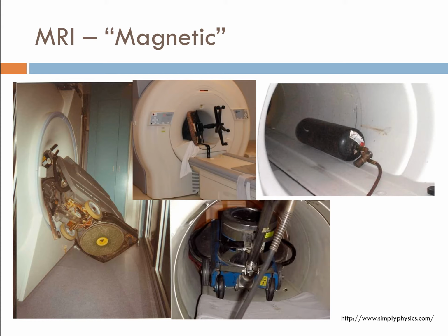A little while ago, they used to use black tattoo ink as eyeliner, and the ink used had a lot of ferrous oxide in it, and iron heats up within the magnet as the RF pulses are put in.